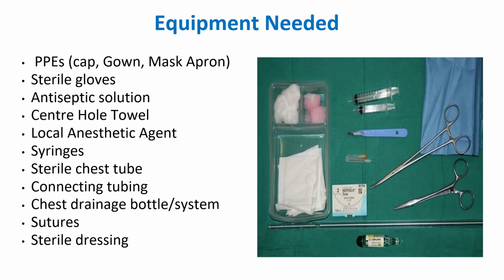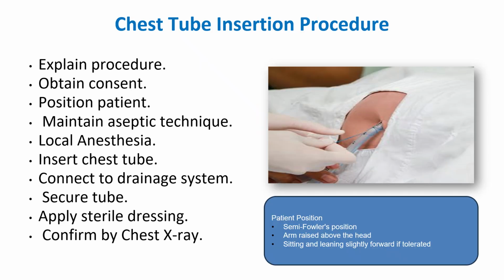Clear with the equipment needed? Okay. So chest tube insertion procedure. During procedure, what happens? These are all the points you need to keep in mind.